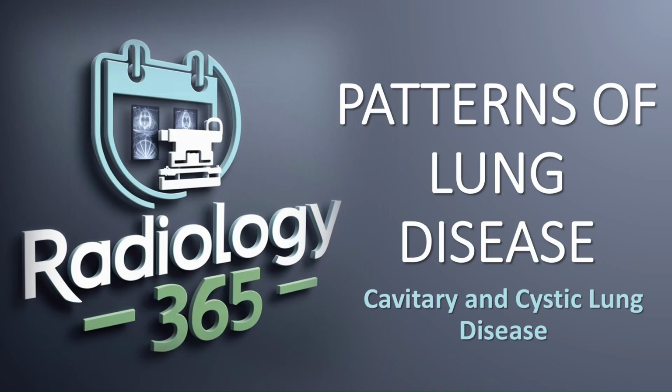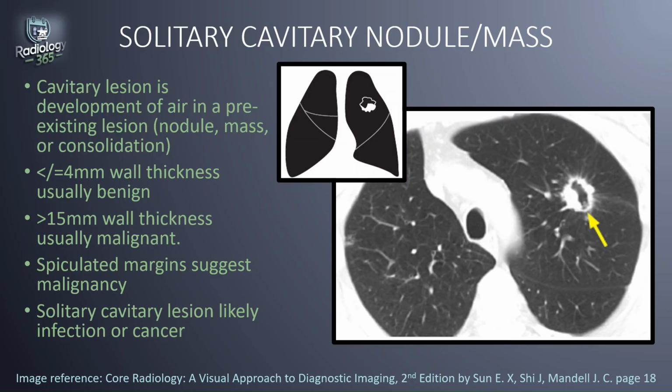Still on the discussion of patterns of lung disease, we are going to be discussing cavitary and cystic lung disease today. A cavitary lesion is the development of air in a pre-existing lesion. So you may have had a nodule in the lung already, or a mass or some consolidation in the lung already, and now some air has developed inside it. It's basically cavitated.